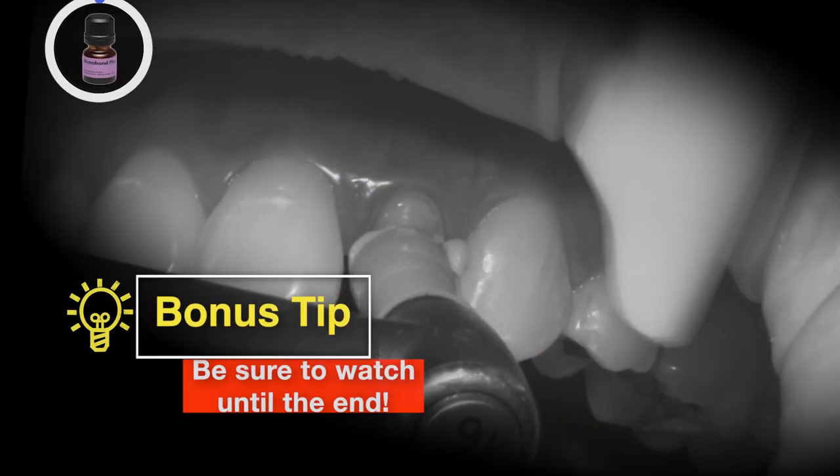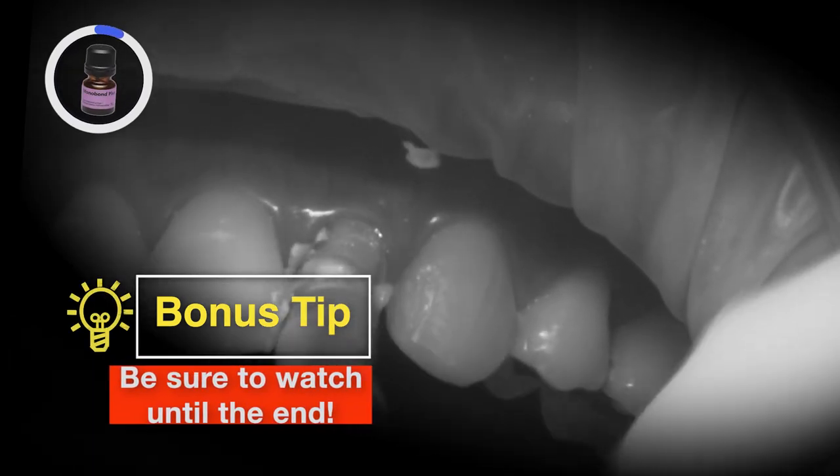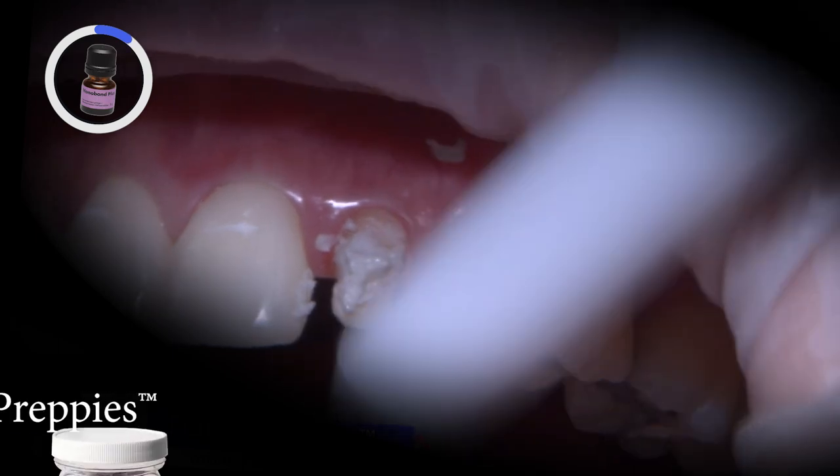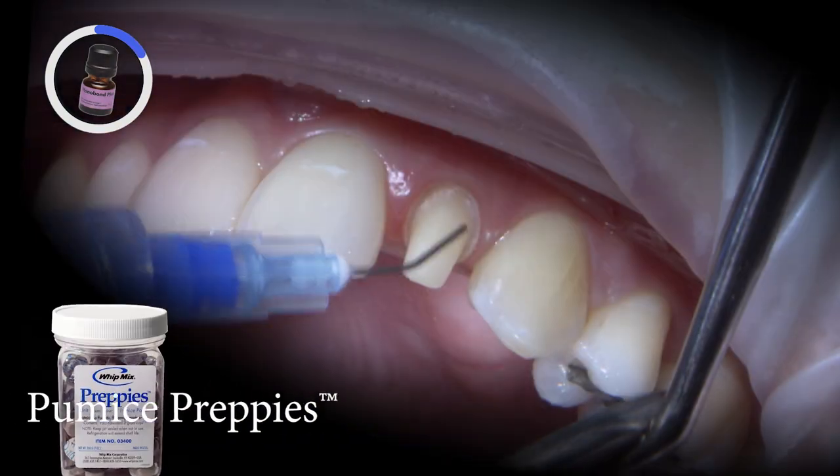With the patient's approval, we are ready to deliver the cosmetic crown using a bonded adhesive cement protocol. I cleaned the preparation with Pumice Preppy's slurry to remove any residual temporary cement.